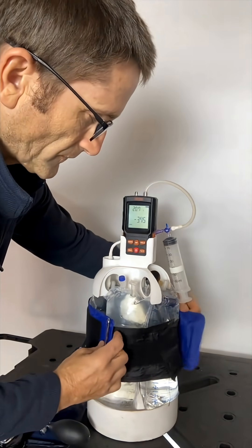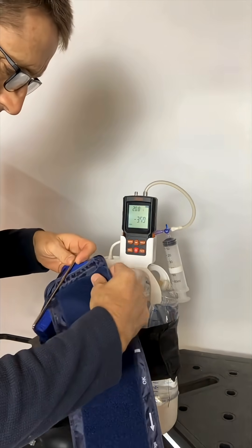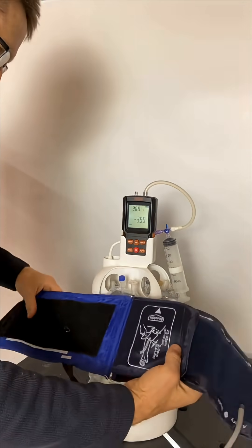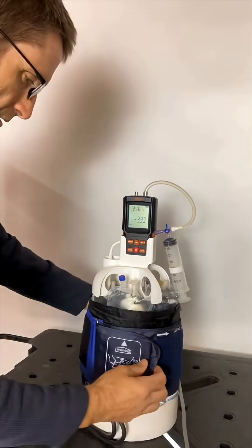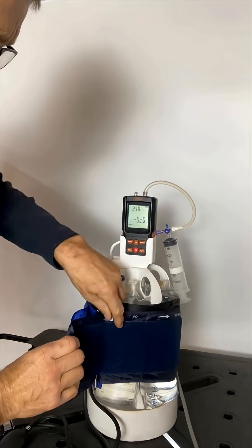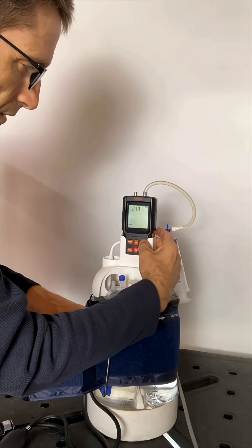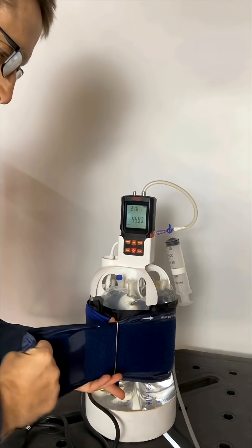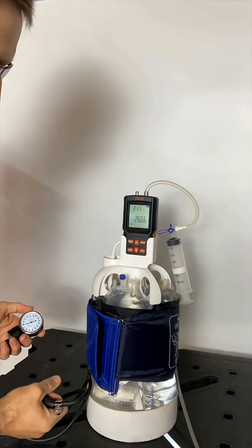So with a blood pressure cuff this is the issue — I actually can't get all the way around. However, if I'm in an ER that's any good I probably have two of these. So I'm going to take it, thread it through, tack that down. They don't have to be the same cuff. You may need to adjust both sides. I'm going to zero this out, make that tight and now I just start pumping.